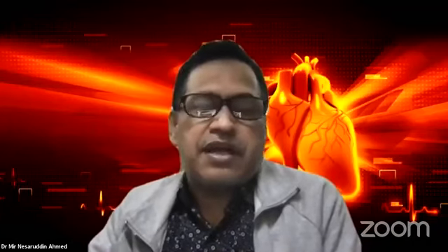And another cardiomegaly cause is the congenital complete heart block. Sorry, that is complete heart block. Chronic complete heart block is one of the important causes. Thank you, Shamim.